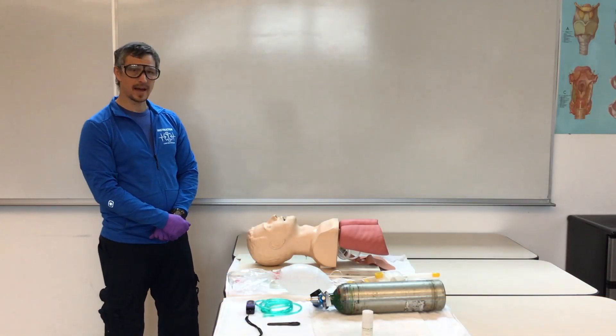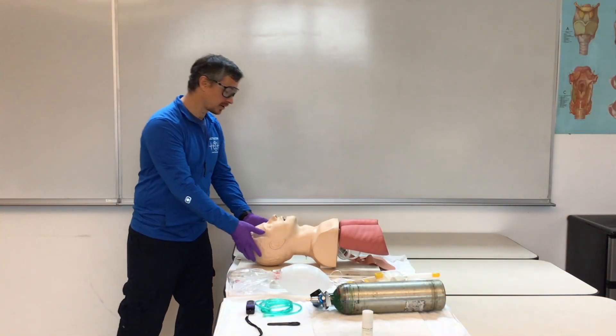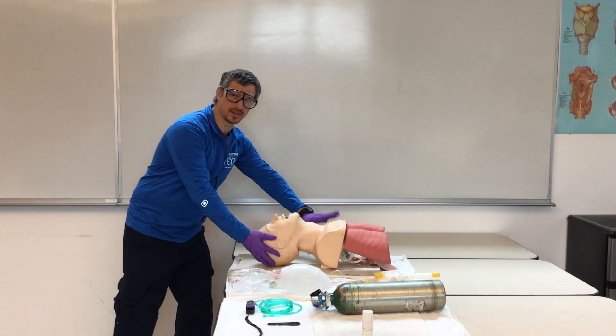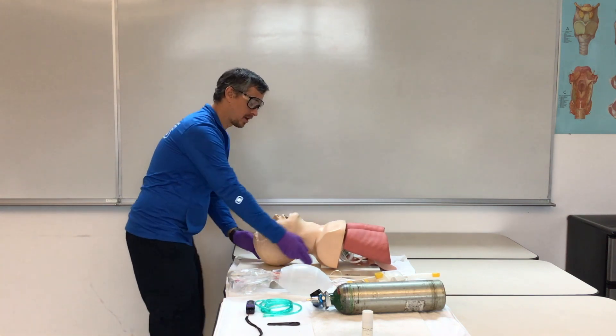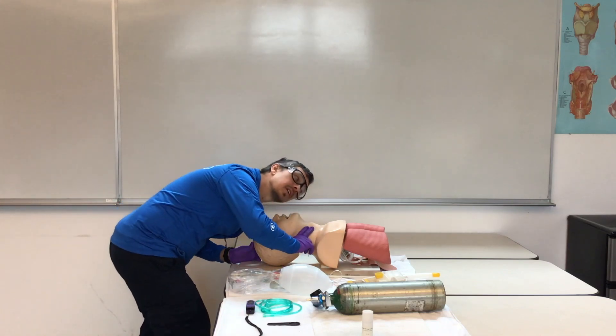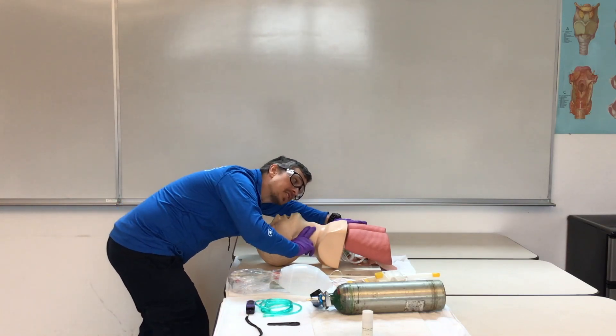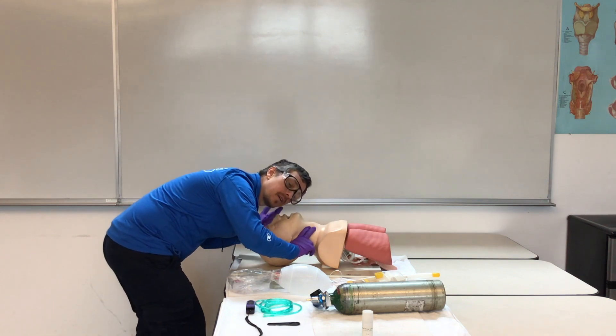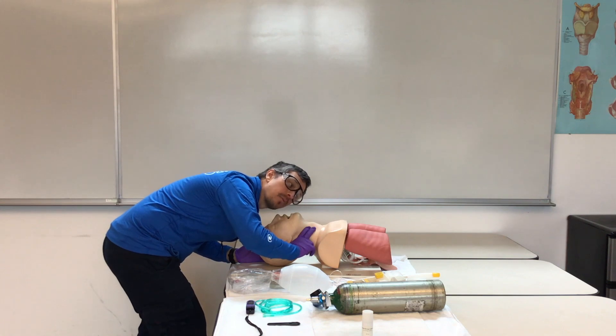To start BVM ventilation on an apnea patient, we're going to open the airway and tap our patient to make sure they're unresponsive. Check that pulse and look down at the chest — we're looking for chest rise and feeling for breath on our face. We have a pulse but no breathing.